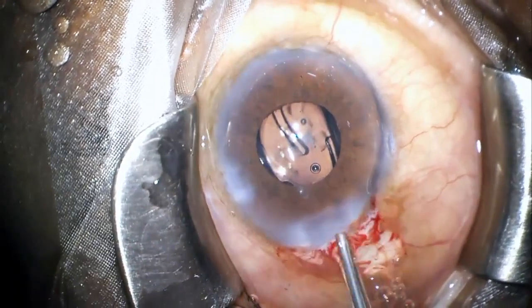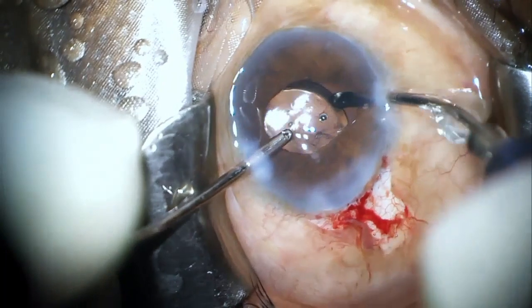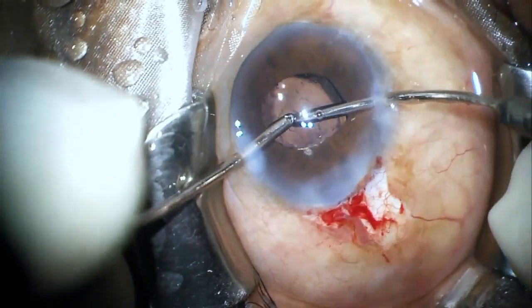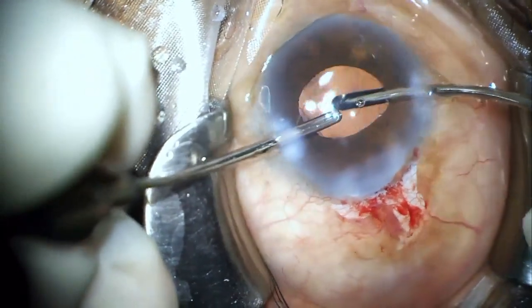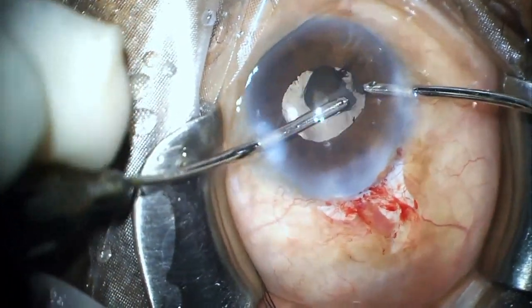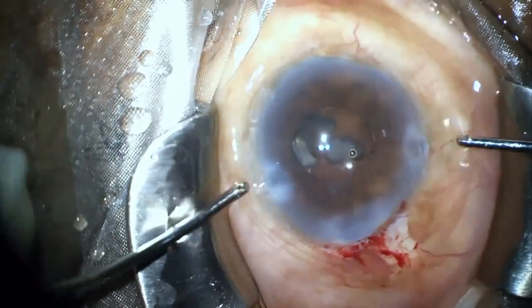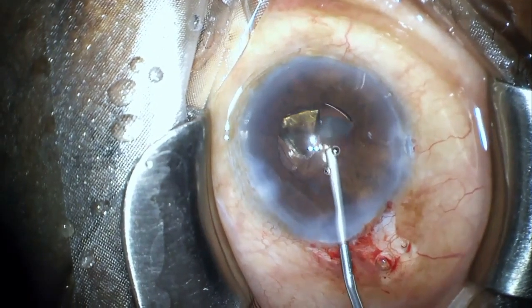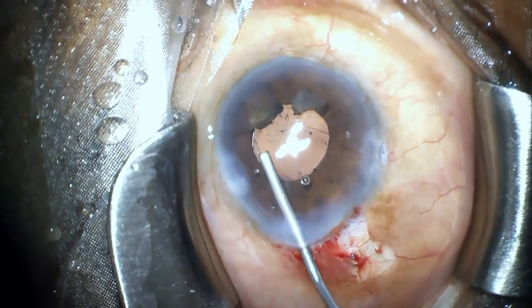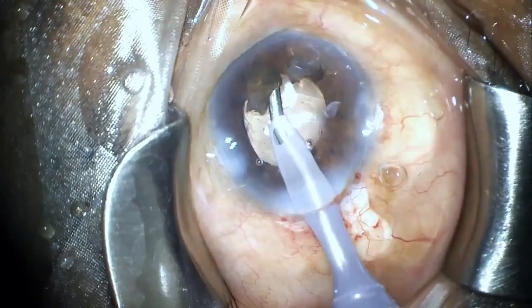Now interestingly, after the lens was put in the bag and as I went behind the IOL to wash the viscoelastic and was tapping on the surface of the IOL, I actually saw the hidden fragment showing up — the one I had been trying to find for a long time. Most likely the fragment was sitting in the extreme periphery of the bag and got dislodged by the placement and maneuvering of the IOL. Finally, the fragment was emulsified and everything looked okay.